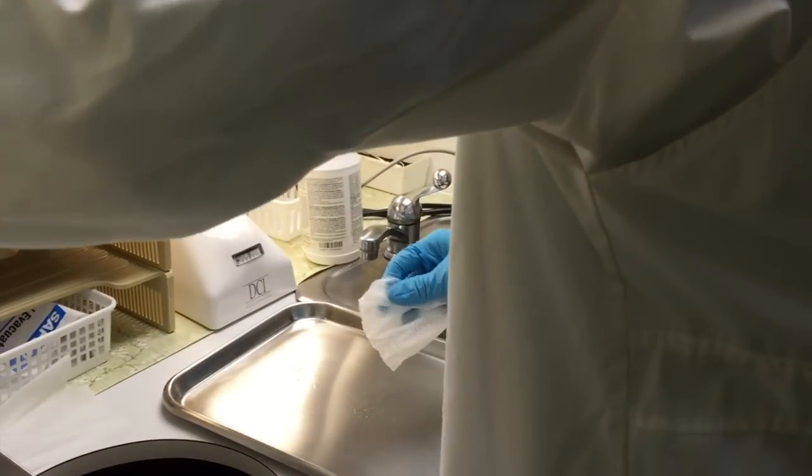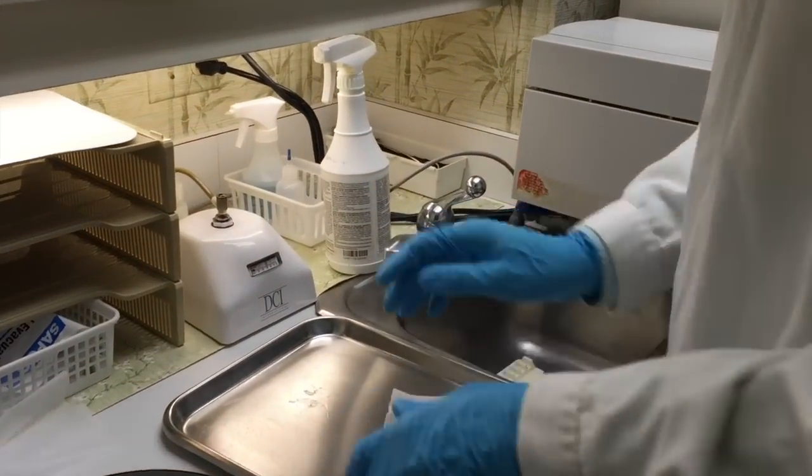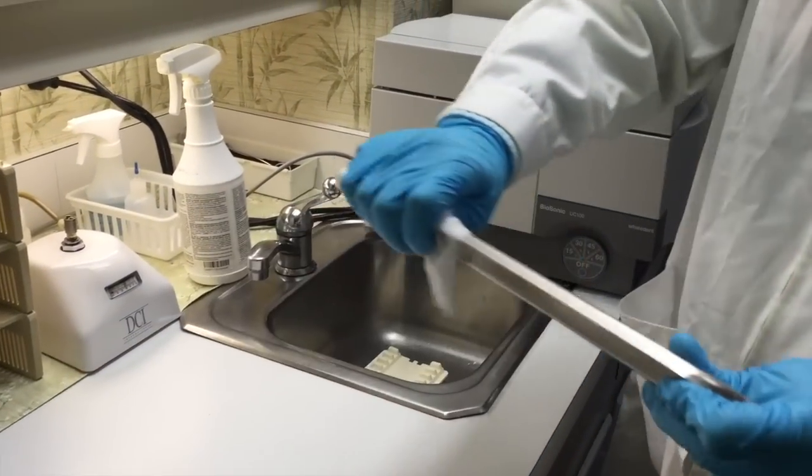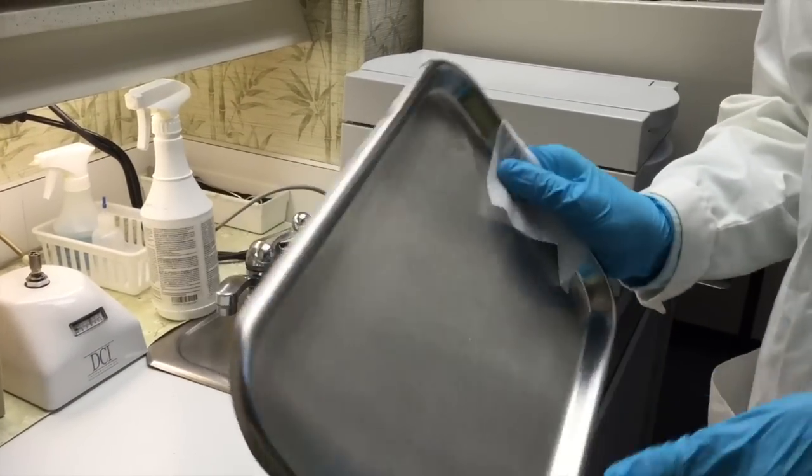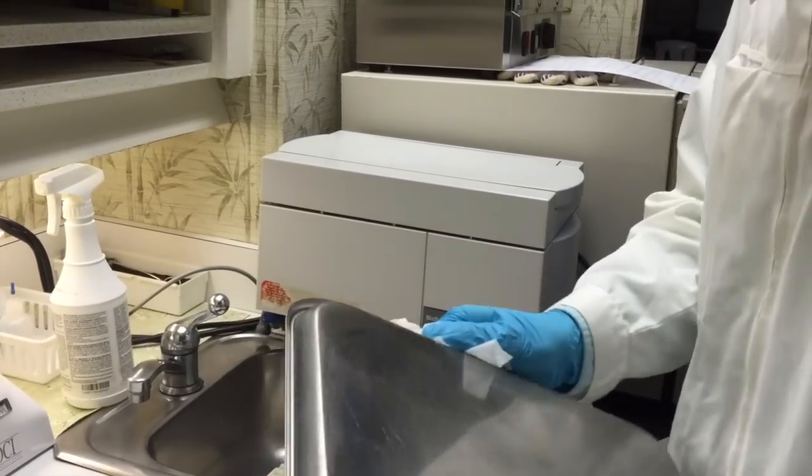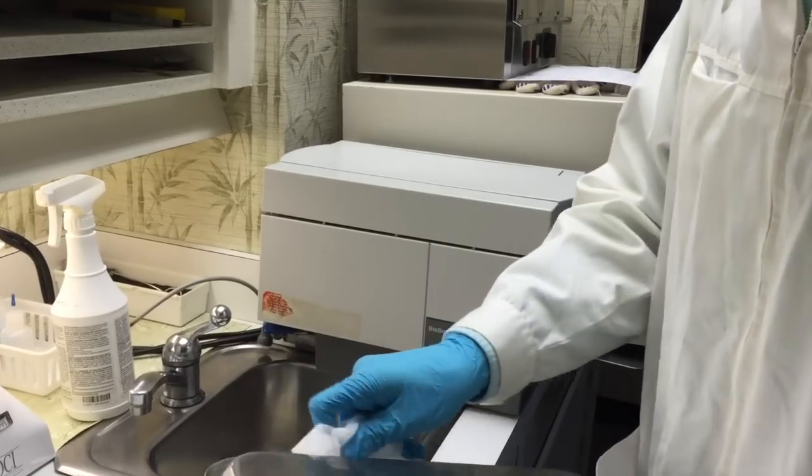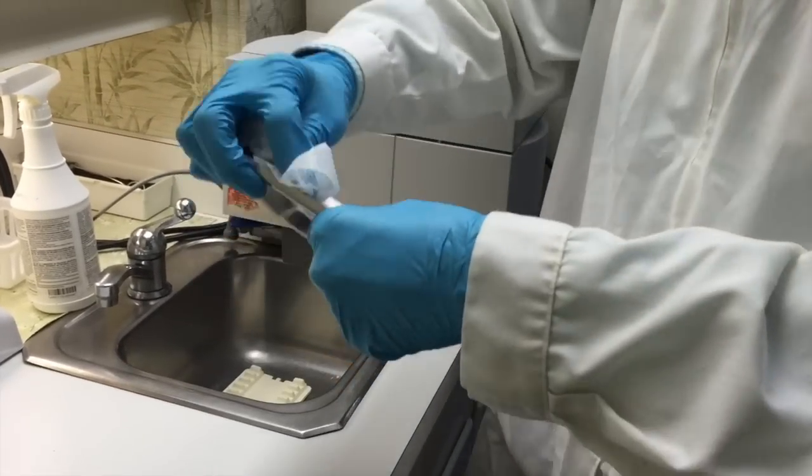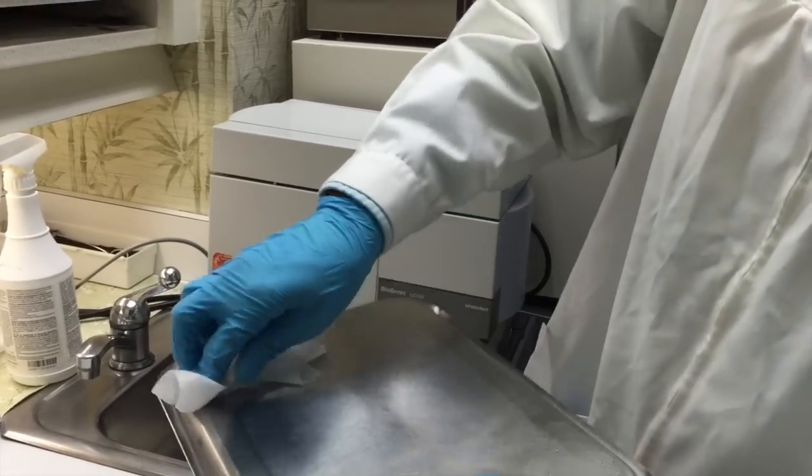We're going to wipe down the tray with a disinfectant wipe. When you do this, you've got to be extra careful because you've got to get all the sides of this. This was sitting near where the dentist was working and there could be any kind of spit that could have flown up on it. So you're going to have to get all the sides, get all the crevices, even where you wouldn't think you'd normally have to clean. You have to completely disinfect the tray. Make sure you get all the edges up under here.